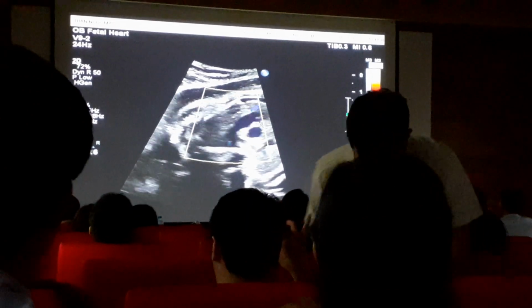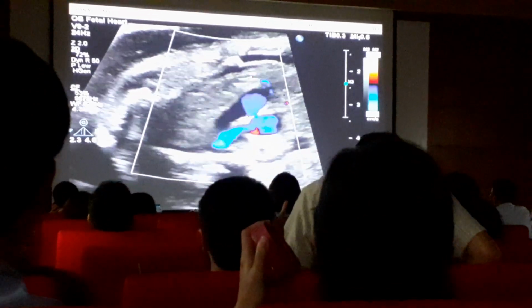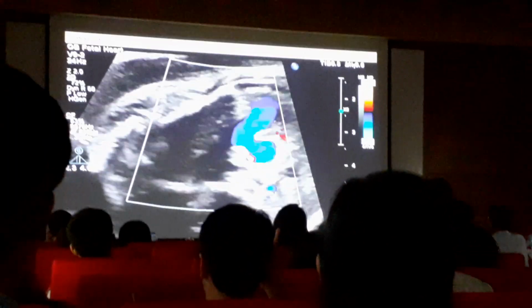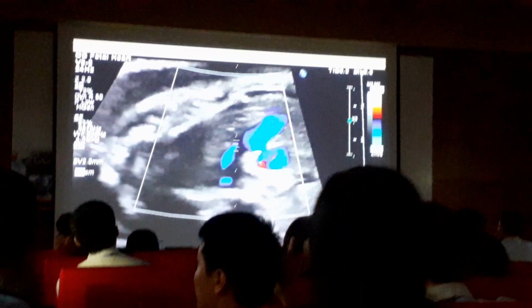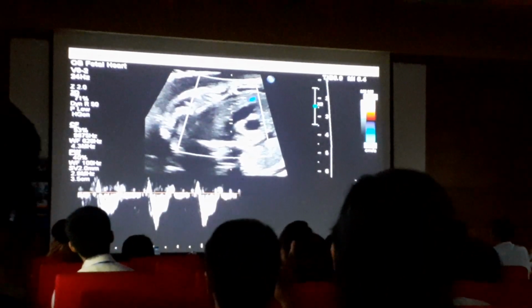So I have this sort of narrowed down to this is just a systemic hypertensive state in this fetus. We've done almost all of the Dopplers, so we might as well Doppler the ductal arch.